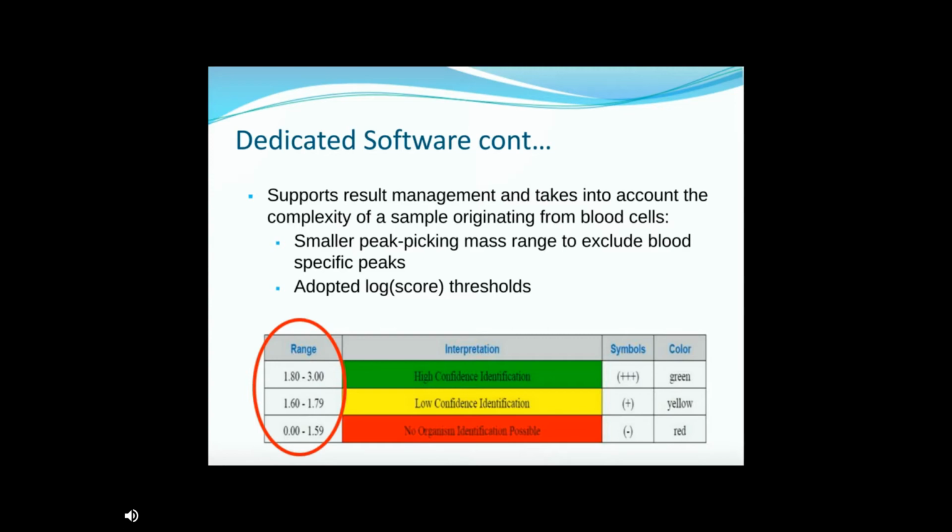99% of the time, if it's in that yellow and we get that low confidence, we are on the right track, but it's just not something that we can confirm and we're positive with, so we cannot put that information into the system to get into the patient's chart. But like I said, we will let infectious disease know that, on the QT, this is what's going on, but we can't put it in the computer, and they're very grateful that we even have that information for them.